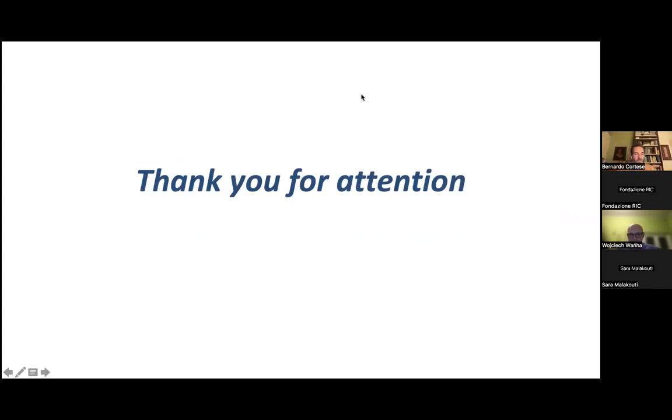Thank you, Wojciech, for this nice and timely presentation. You discussed very interesting papers on the topic. Those from Francesco Prati and Opolski are important trials that underline the importance of OCT for understanding the presence of vulnerable plaque. And this is the good part.